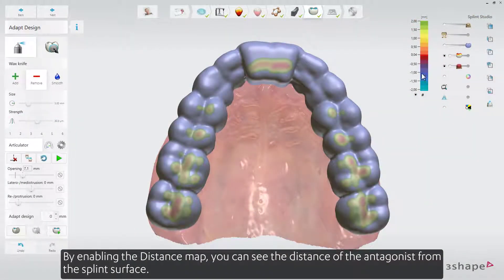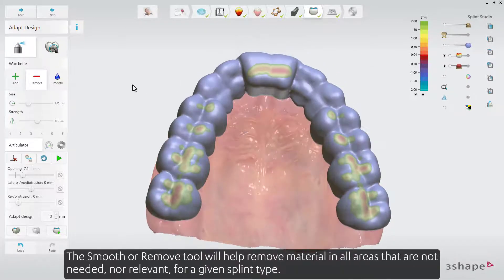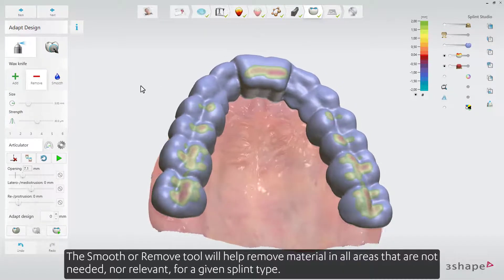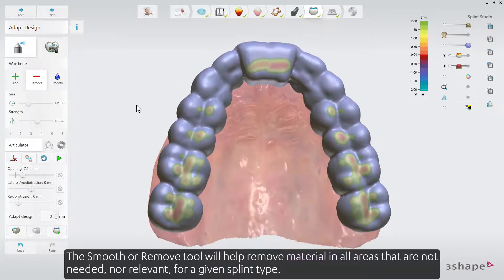By enabling the distance map, you can see the distance of the antagonist from the splint surface. The Smooth or Remove tool will help remove material in all areas that are not needed nor relevant for a given splint type.